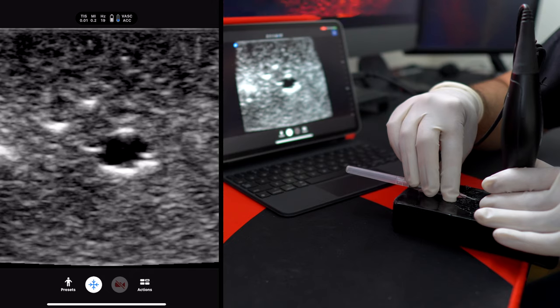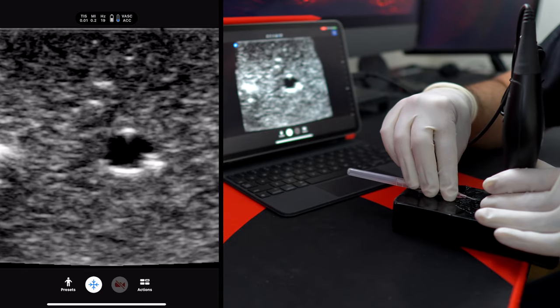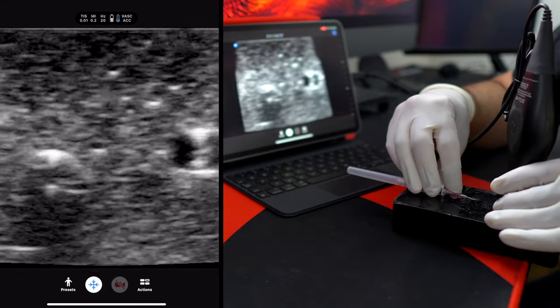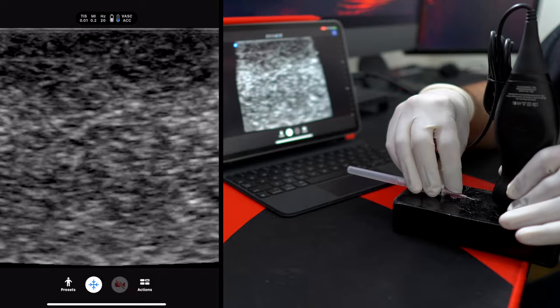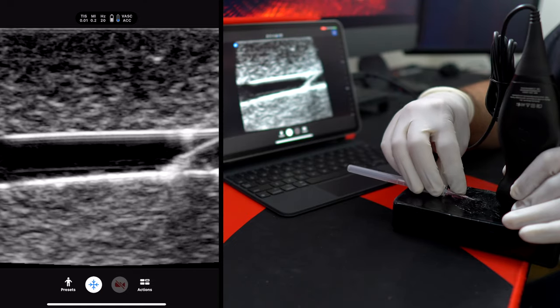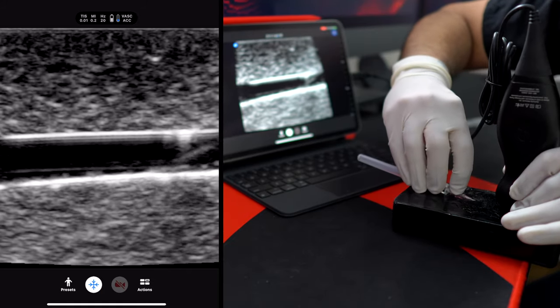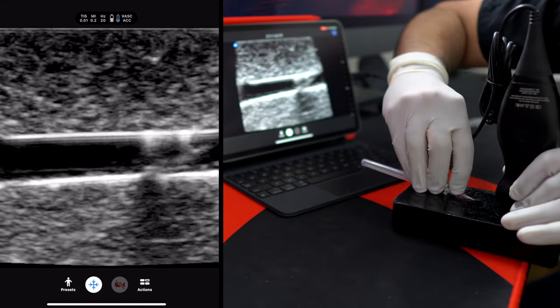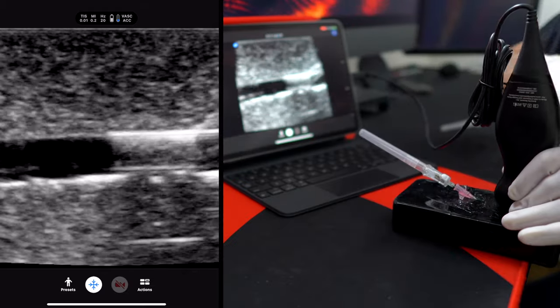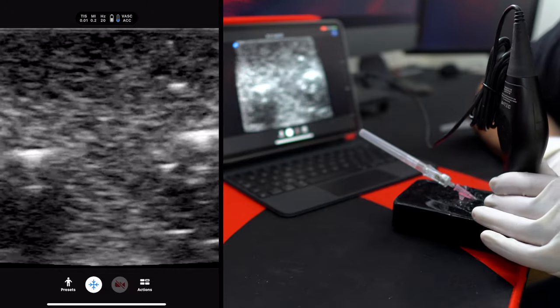At some point you'll reach the deep portion of your vessel and you can only flatten out so much. At that point it's prudent to go ahead and thread the catheter off. You can even try to do this in long axis if you want to be fancy. Right there you can see my needle on the screen as I thread the catheter off in the gel material — you can start to see it move. I've hubbed it, so my catheter is well within the vessel. I walked it in in short axis and confirmed it in long axis — good to go.